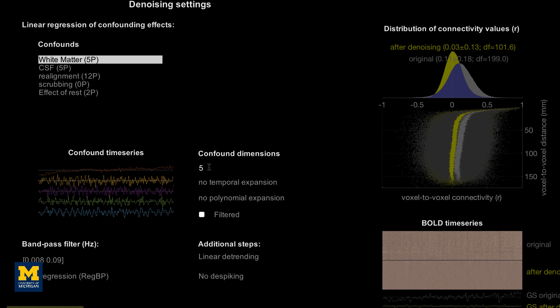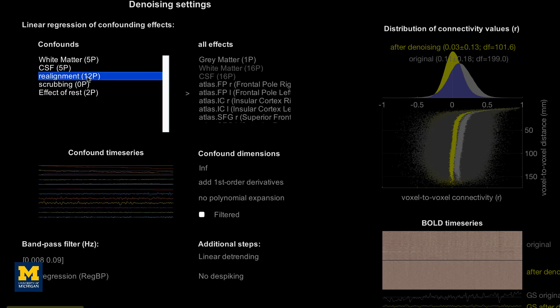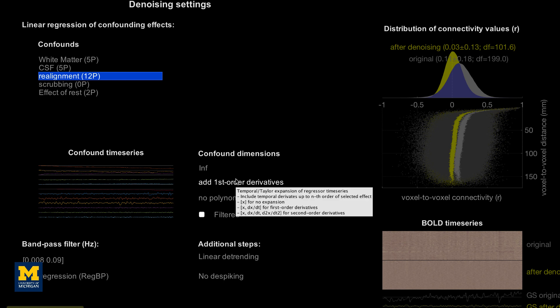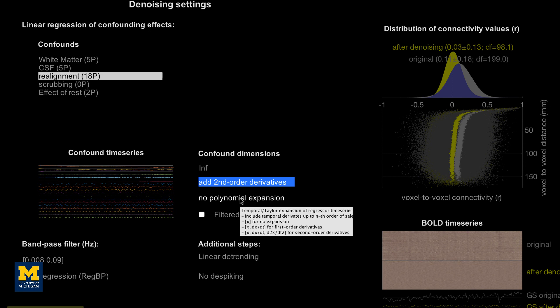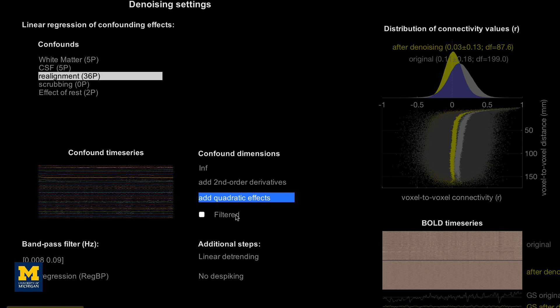Within this panel, you can also choose to add higher order derivatives. If this is done at all, it is usually done to the motion regressors specified here under realignment. For example, first and second order derivatives can capture more subtle movements that are not accounted for by the traditional translations and rotations. Polynomial expansion is a similar concept, adding either a quadratic or cubic exponent to the regressor, although this is not commonly done. For now, I'm going to reset these back to their defaults.